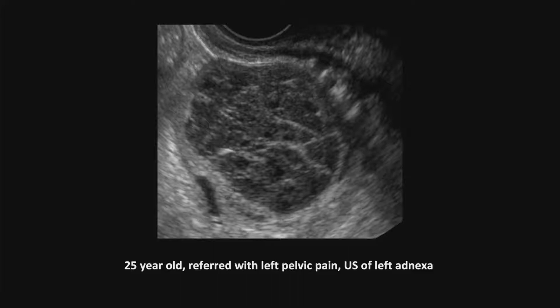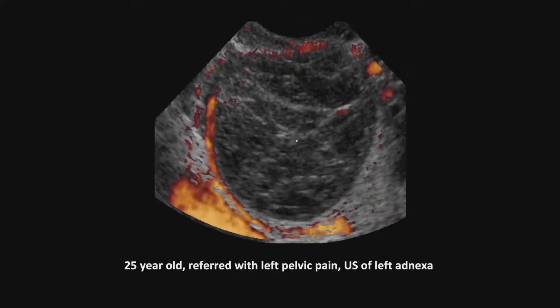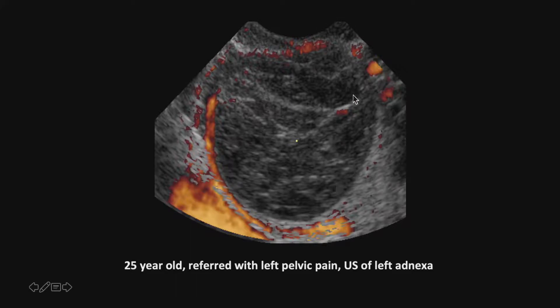25-year-old, referred with left pelvic pain. That's an ultrasound of the left adnexa. So what do you think that is? We added color to this — this artifact here — and you can see that with a low velocity scale picking up all capillary flow around, I don't see any blood flow in there.